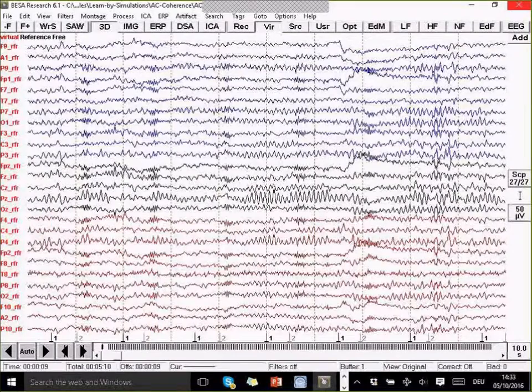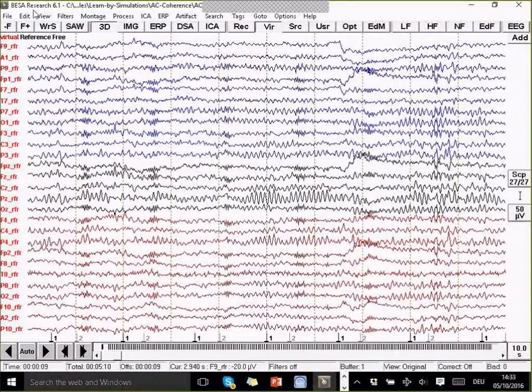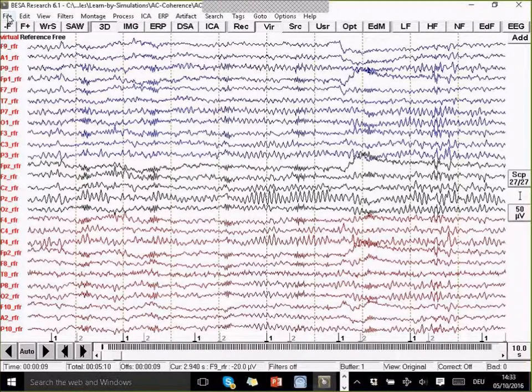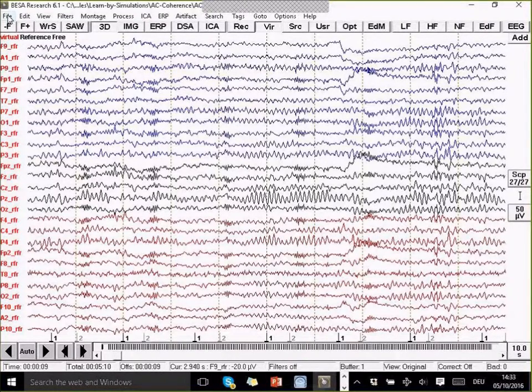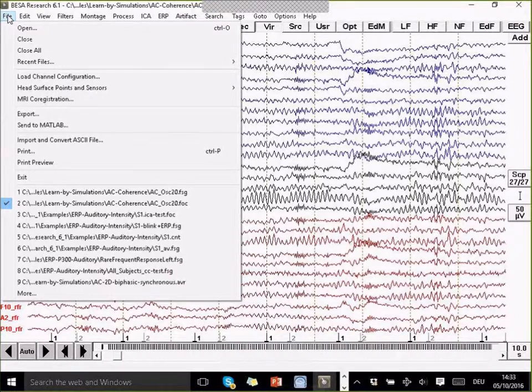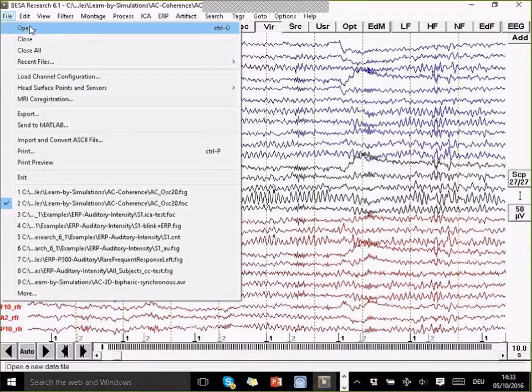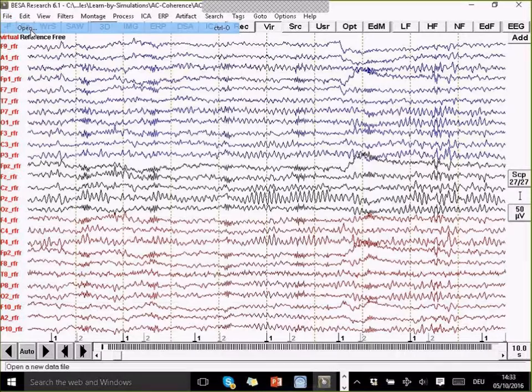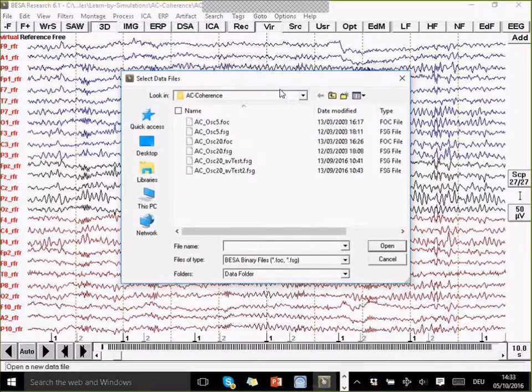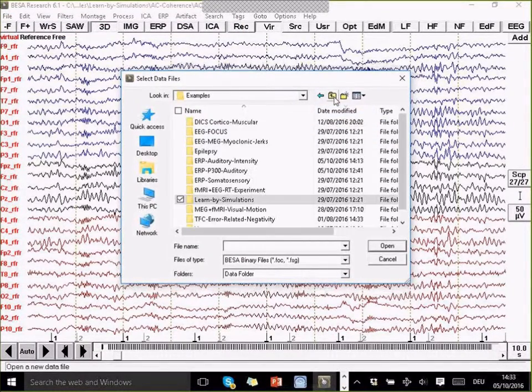Then I also want to show one thing, one application with real data. And that is the DICS applied to an experiment where there was a potential coherence between the cortex and the muscular activation.